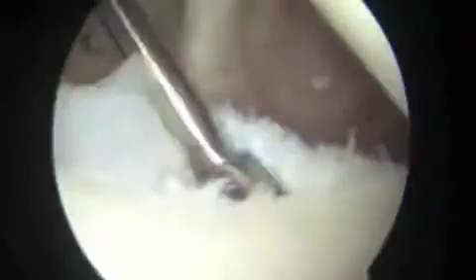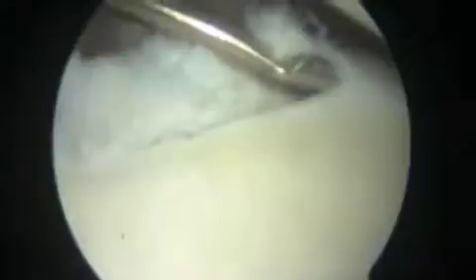There, it's torn off. This is an instrument that's elevating the torn labrum from the socket so that we can later fix it back directly where it needs to go.